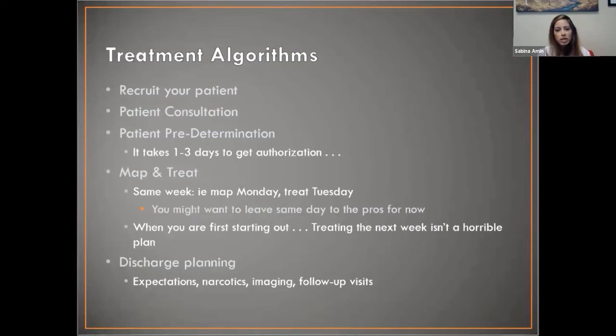The map and treat. We do these in the same week. Sometimes we'll map on Monday and treat on Tuesday. You might want to leave the same day map and treat to the pros for now, because when you're first establishing something, it can be a little bit of a bear with your schedulers to figure out. When you're first starting out, treating the next week isn't a horrible plan because it gets everyone on the same schedule at the same time.